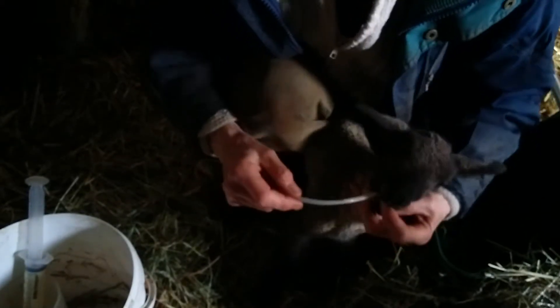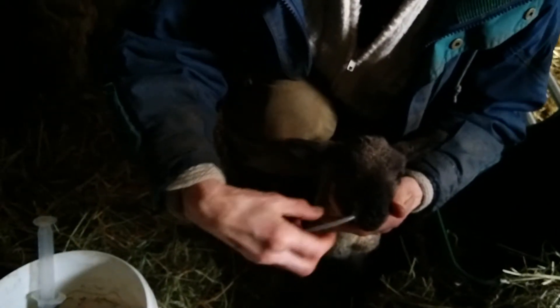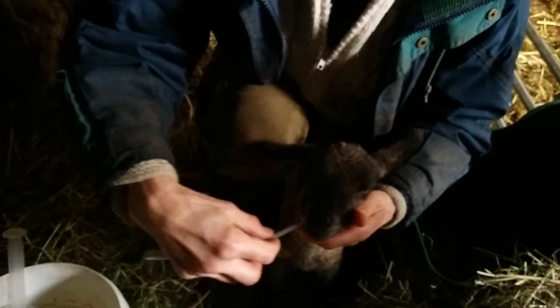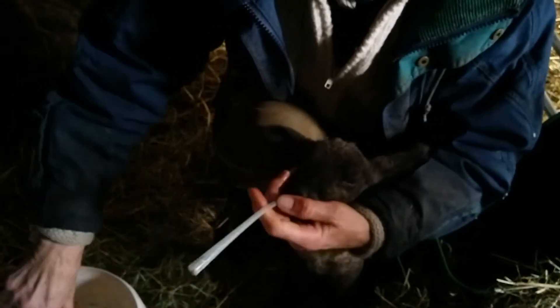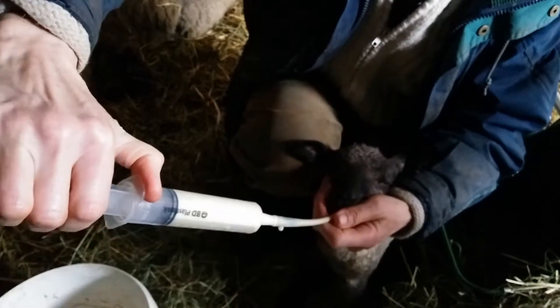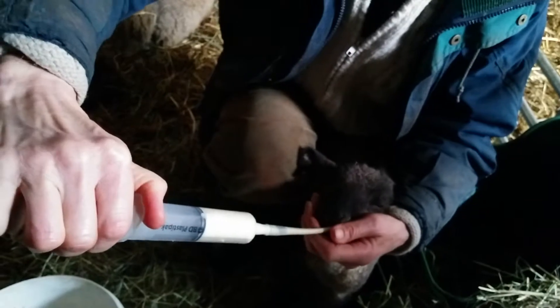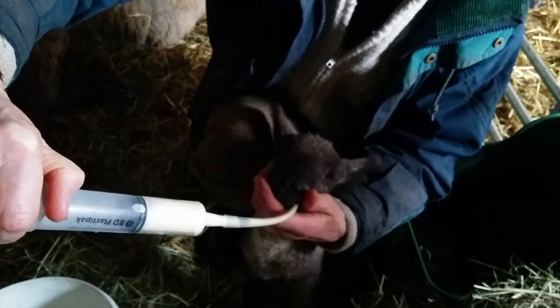These two little tiny lambs aren't very strong, so we're giving them some colostrum, but you've got to pop it in via a stomach tube. As you can probably see, just feeding it in gently — the lamb is supposed to swallow it, chew the pipe a bit, and actually swallow it, so you get it going down the right pipe rather than filling the lungs up with milk, which is a bit of a disaster if you do that. It's not the most comfortable sensation in the world, I wouldn't have thought.